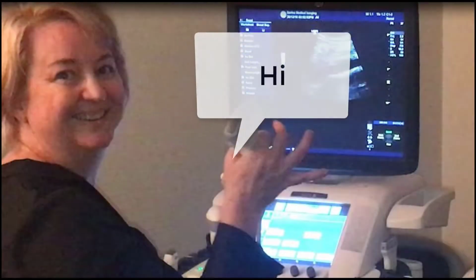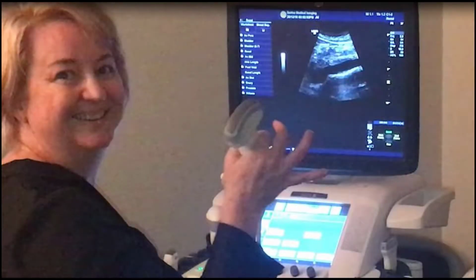Hi, my name is Rebecca and I'm a sonographer, which is someone that performs ultrasounds. Today I'm doing a video on how to scan an aorta.